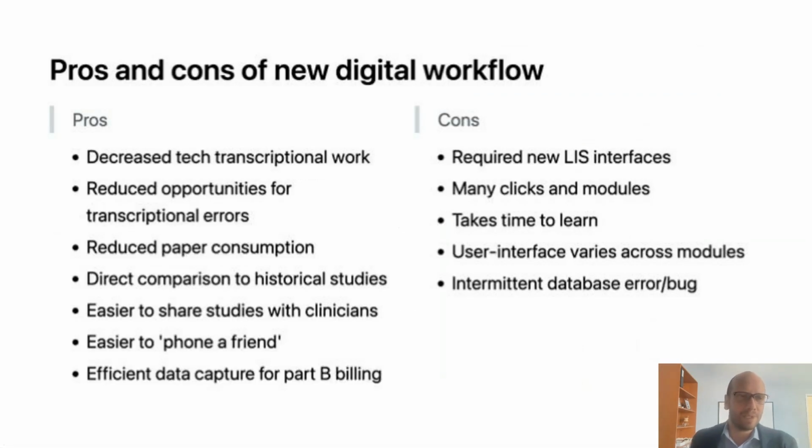So that's a lot of detail. Let me zoom out. The pros and cons of our new digital workflow. There's a lot to like. We have dramatically decreased the transcriptional work burden on the technician. And as laboratories continue to be squeezed for staff, I think this is the primary value, the real core value of this transition.